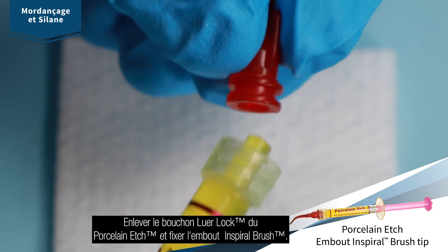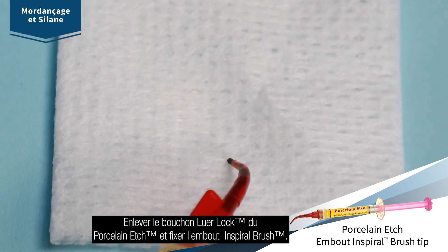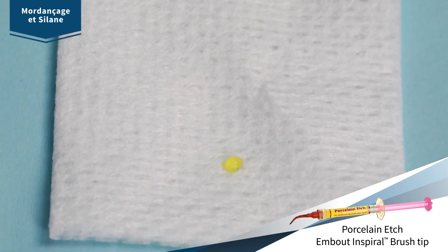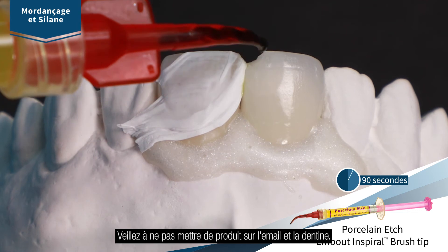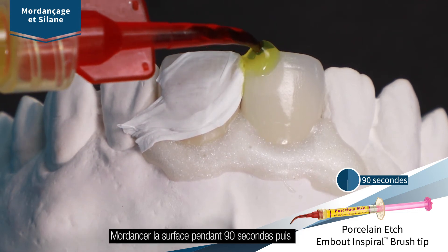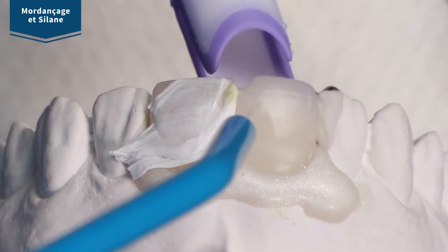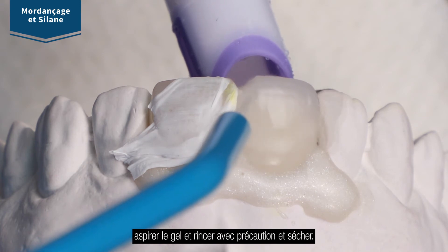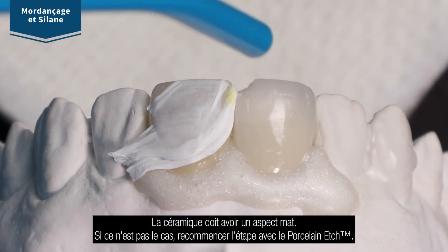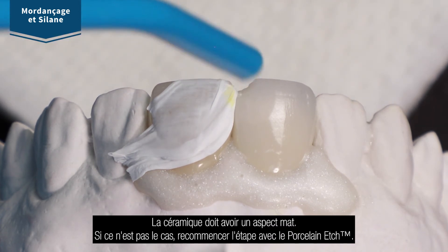Remove luer lock cap from porcelain etch and securely attach the spiral brush tip. Verify flow and consistency before applying. Being careful to avoid enamel and dentin, slowly express an even coat onto the prepared porcelain for 90 seconds. Suction acid from surface, then thoroughly rinse and dry. Porcelain should have a frosted appearance. If it does not, repeat the porcelain etch steps.